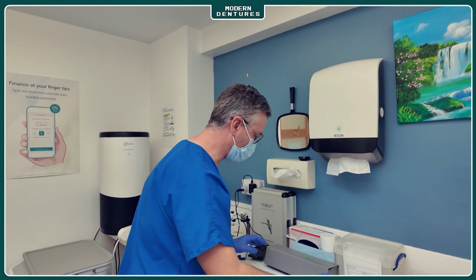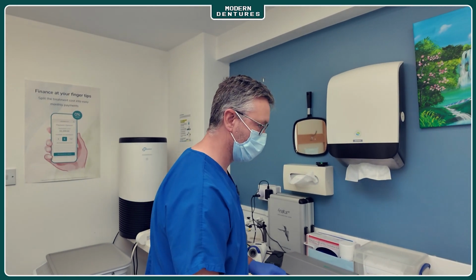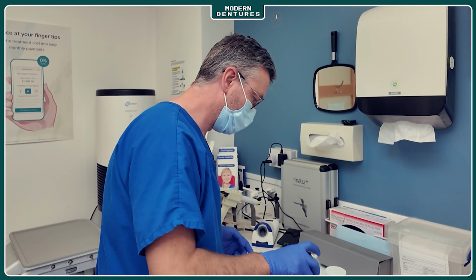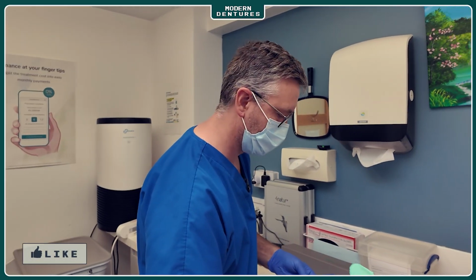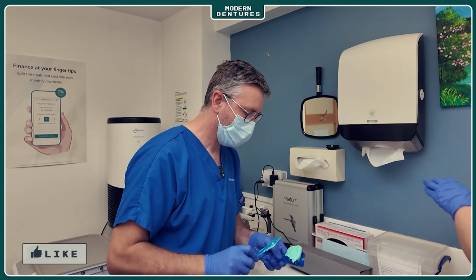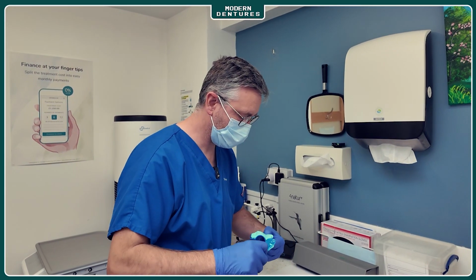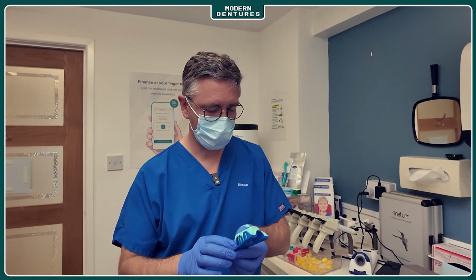Okay, so we've checked the trays. Now we need to mix some alginate. We need some spray on these as well. The denture's in situ at the moment, so I'm going to take the top one first. I always pop a little bit on my glove just so I can see when it's set.